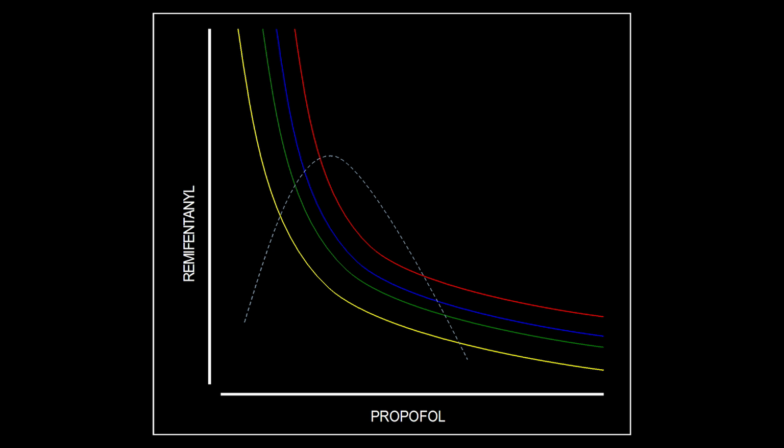The main weakness of this system is that the interaction model does not use the probability of non-response, PNR, as an objective variable. For these systems, the PNR is an outcome variable that is calculated based on the doses that are being administered. This means that the anesthesiologist, despite knowing the PNR, cannot adjust or modify it according to the anesthetic requirement.